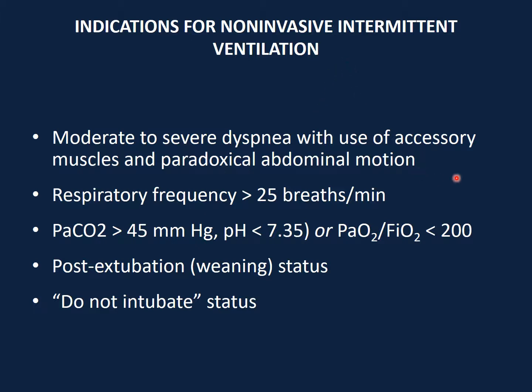Some indications for non-invasive ventilation: most of the time, you may not want to intubate someone, so you want to use non-invasive ventilation to help the patient tide through that period of difficulty in breathing. All these are some of the indications for non-invasive ventilation. With a particular note for this last point, do not intubate status. Sometimes there are patients who allow themselves to be resuscitated, but they do not want to be intubated. In other words, they do not want to be on a breathing machine. So if the patient has difficulty breathing, but we cannot put in an artificial airway or an ETT to help the patient breathe, then non-invasive ventilation might be suitable.